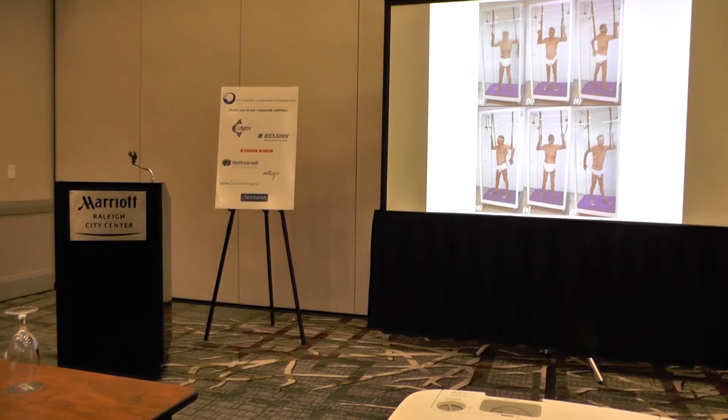In this particular arrangement, it looks like they have some ropes that come down and just help hold people's arms in the right position. But you know, it's challenging. This is a challenging treatment to receive. Now at Duke, we have commissioned a technique to treat people lying down.